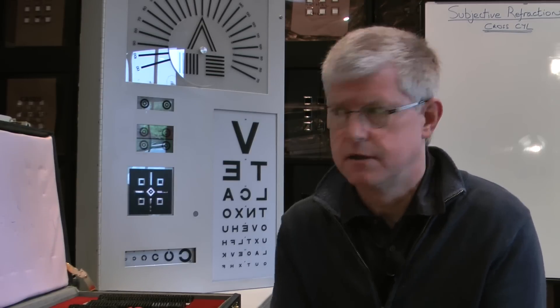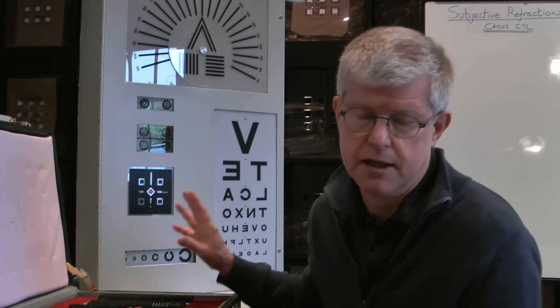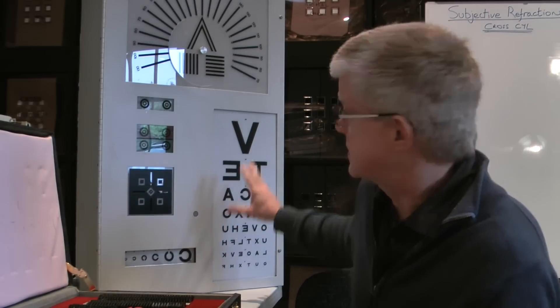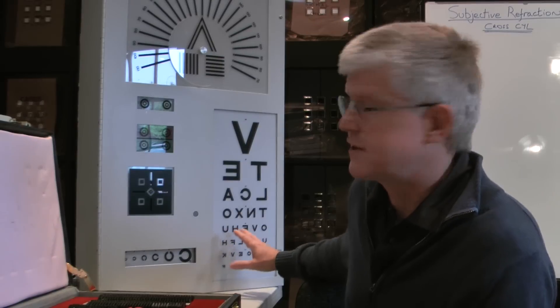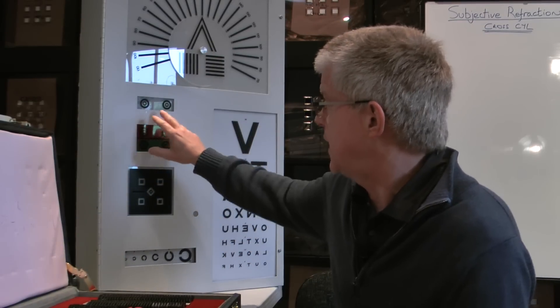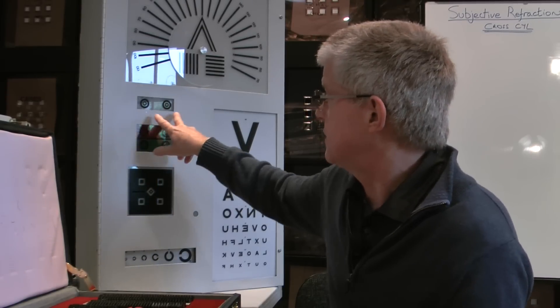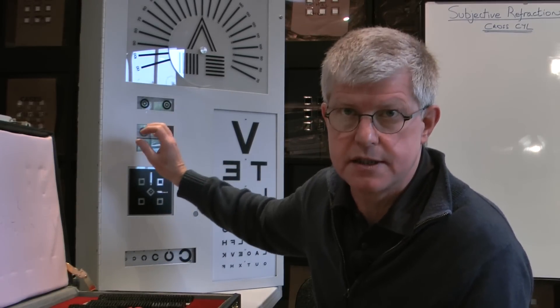I'm going to start by going through the equipment that you'll need to do this. You'll need a slightly more sophisticated chart than what we've been looking at so far. We have a chart here that has a Snellen chart, which we all know — it gives us a measurement of their visual acuity. We also have a target which is two concentric circles on a white background, and that is what we use when we're actually doing cross-cyl.